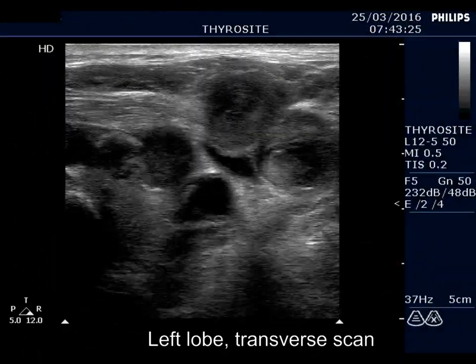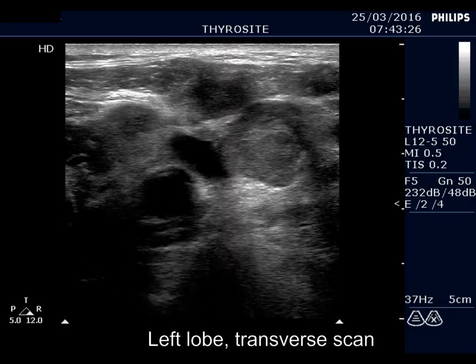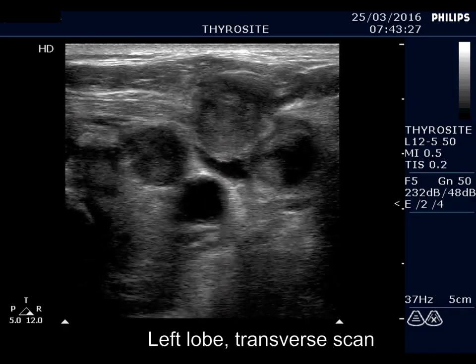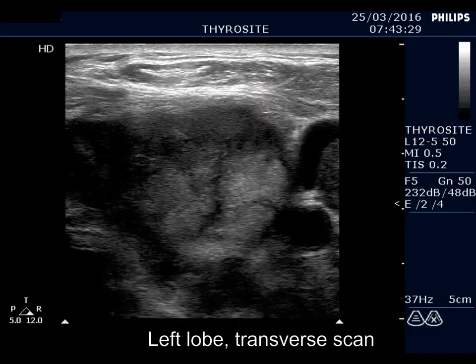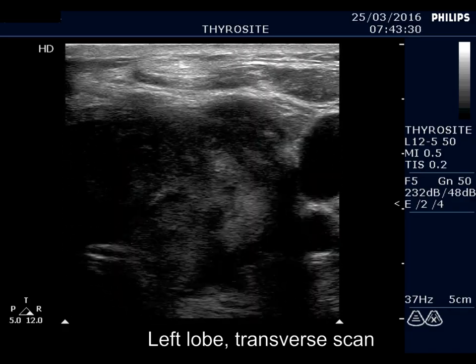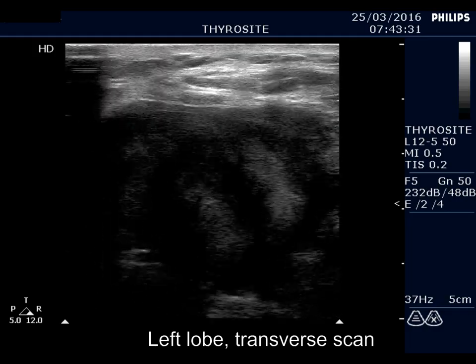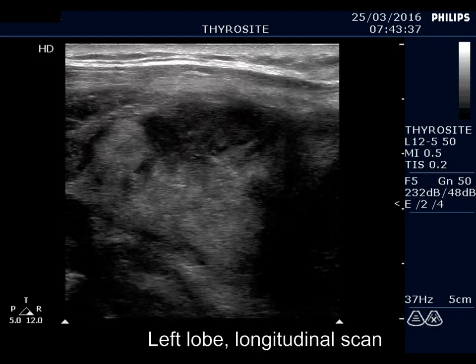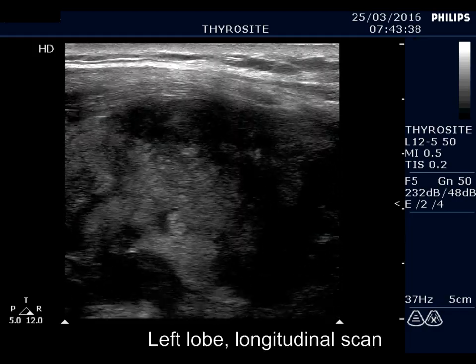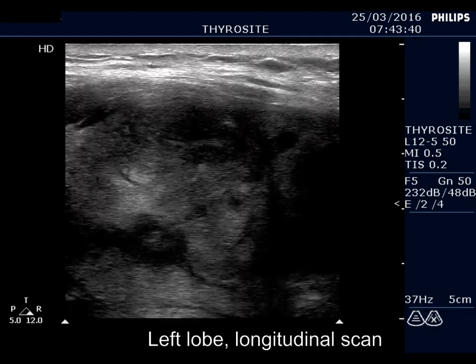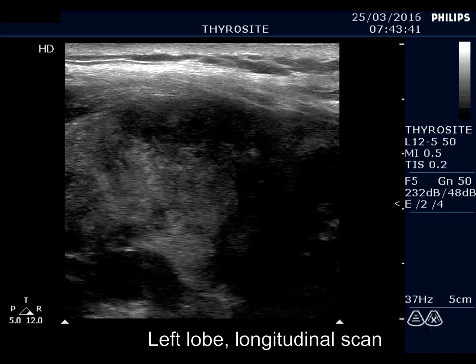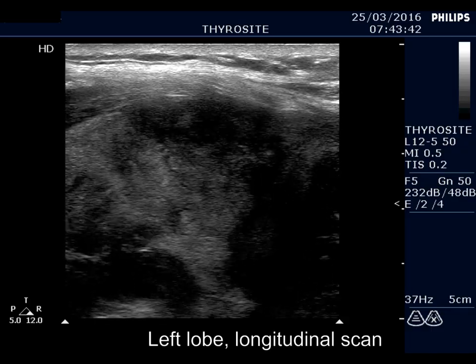First, we are above and ventral to the left lobe, and now the lobe is presented. A large, inhomogeneous, partly deeply hypoechoic, partly minimally hypoechoic or econormal mass occupies the left lobe.